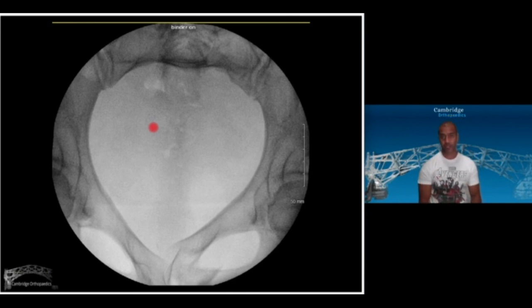This patient didn't have an LC3 — it was an LC1, but it was an unstable LC1. Putting a set force through this pelvis demonstrated that it compresses up and she's in pain, so we need to fix this. The strategy is thus: I need to bring the front to a normal position to restitute the pelvis before I compress the back. When there isn't a great deal of deformity, what I do is put my SI guide wires at the back, fully happy that I know exactly where they're going, then put my strut in the front, pull it through, overdrill the back a little bit — and that gives me some wiggle room for those screws to manoeuvre and create compression.